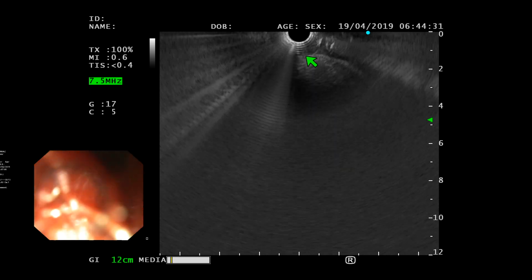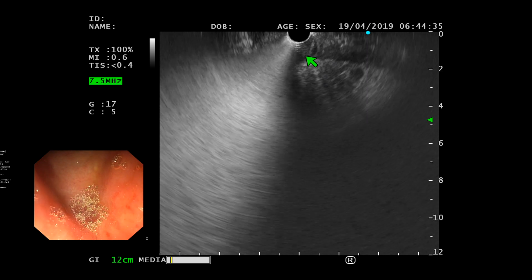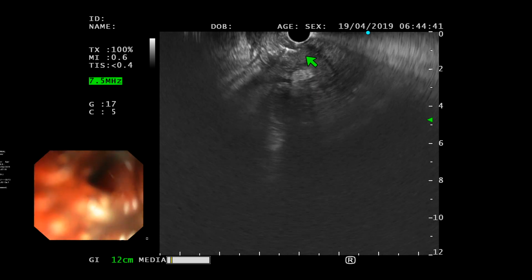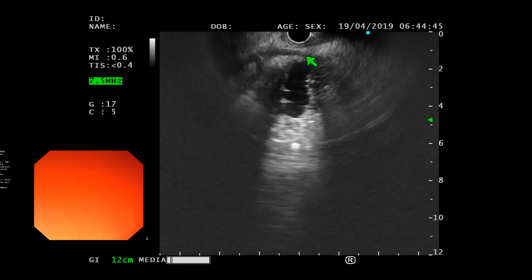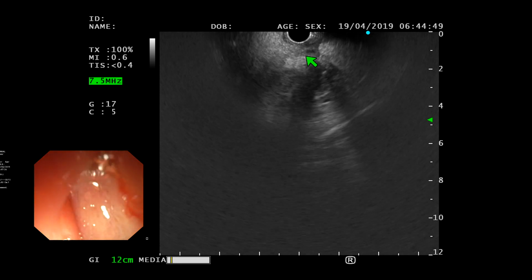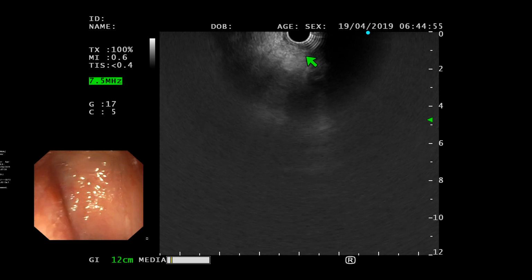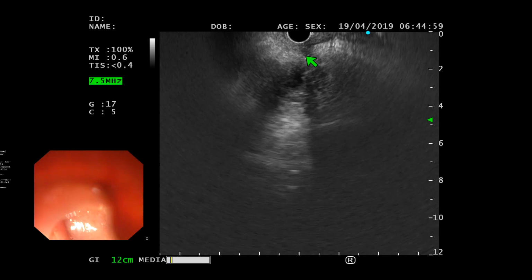Yes, how old is the patient? 61. Okay, thank you. Of the mass. So would you go for no? 55. My apologies, age is 55. 55, beg your pardon. So this is one. Help?